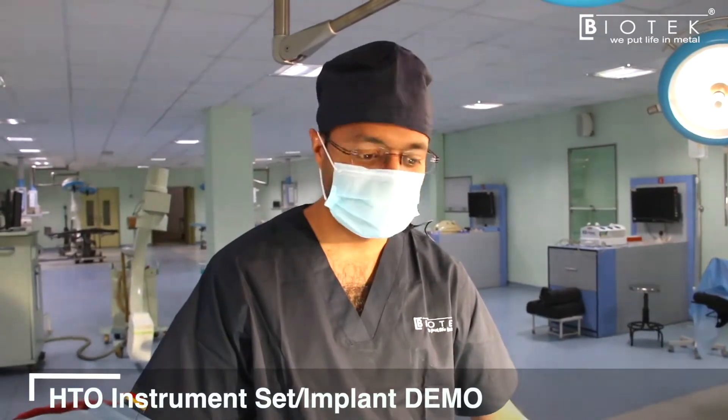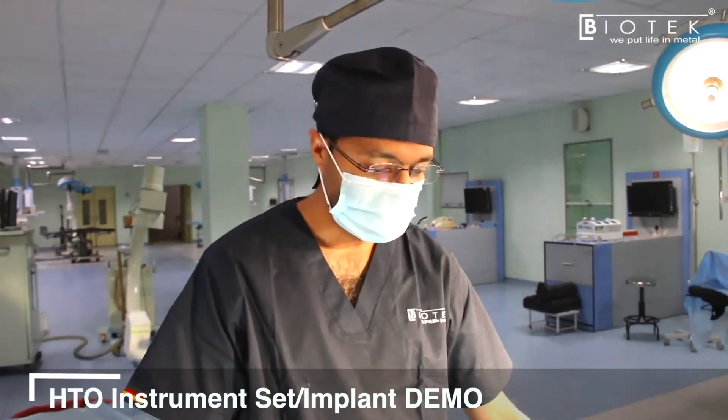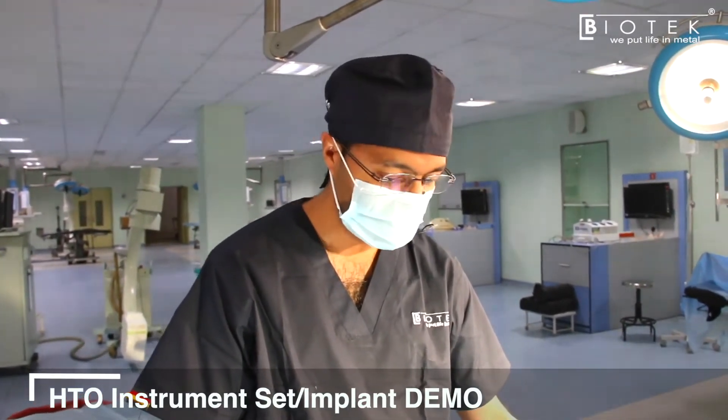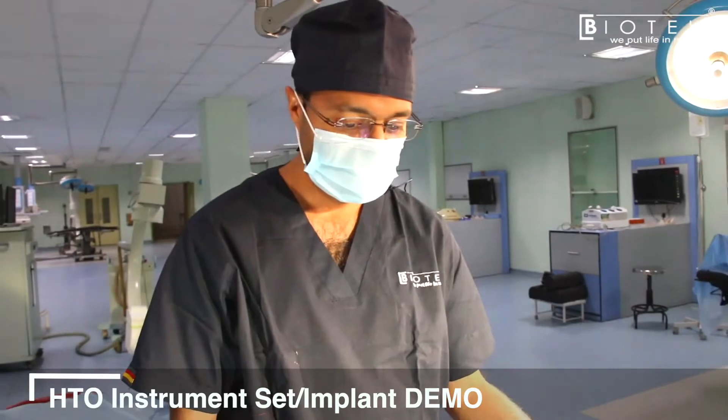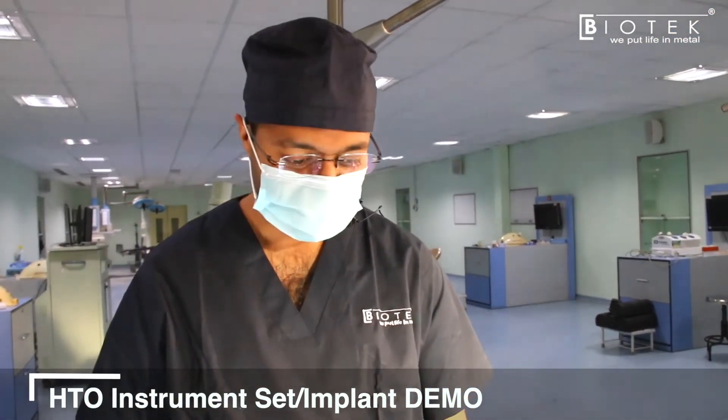We will be presenting the Biofix NP osteotomy system from Biotech. I will take you through the implant and the instrumentation system that we provide for you to perform a high tibial osteotomy with accuracy and success.